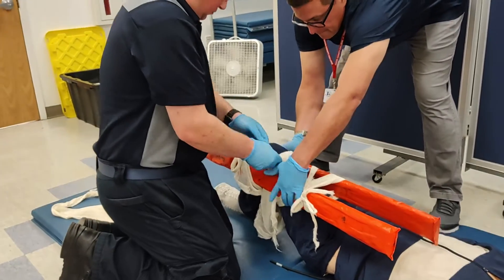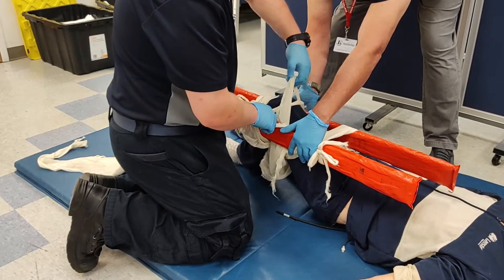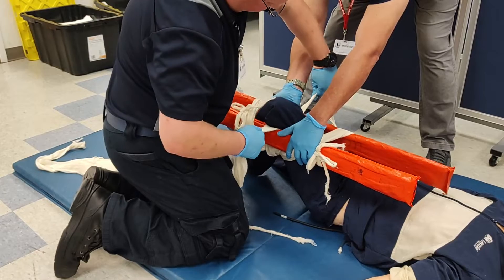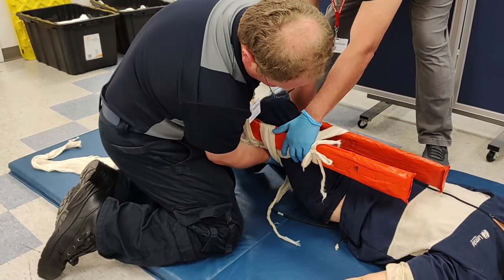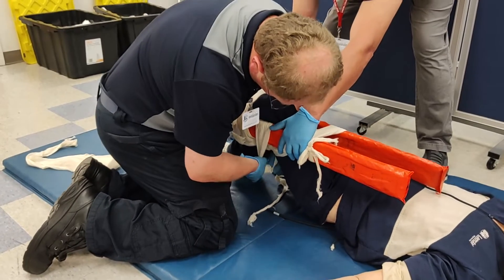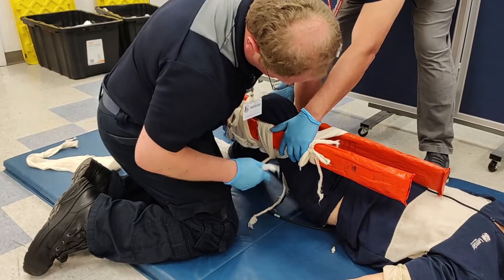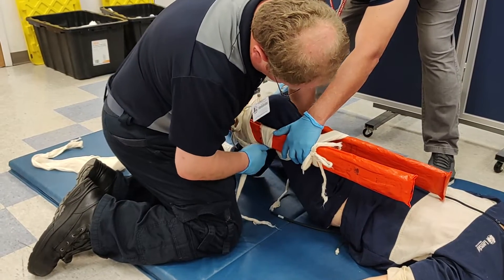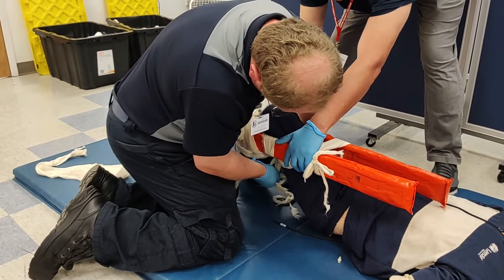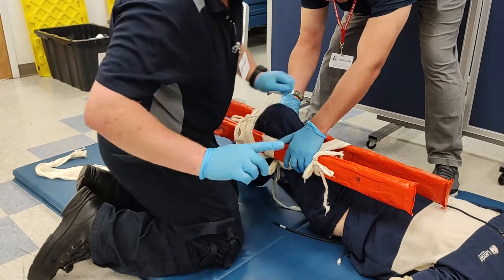The first cravat — the one that does not go around the patient's knee — is retrieved and untied so that it can be passed underneath the patient, around the splints only, and tied with the utmost tightness. This final cravat is the largest load-bearing strap in the splint.